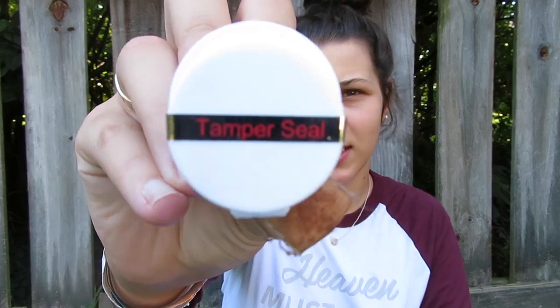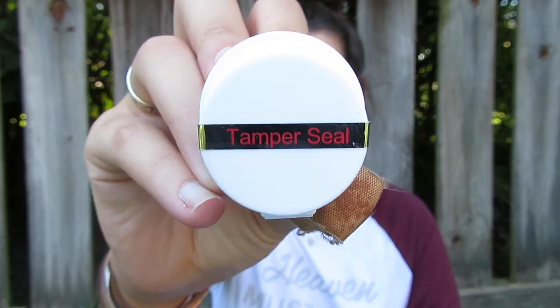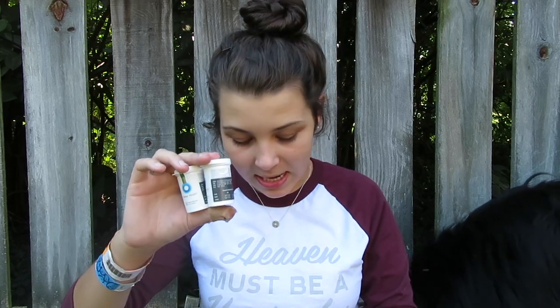I got three vials of 50 strips to start off with. There is a tamper seal on them — obviously I've used one, so mine is broken — but if the tamper seal is broken when you receive it, don't use the strips; send them back and contact the company. Their customer service is amazing, by the way. If you just message them on Instagram they respond super quickly and tell you to email them with the problem.